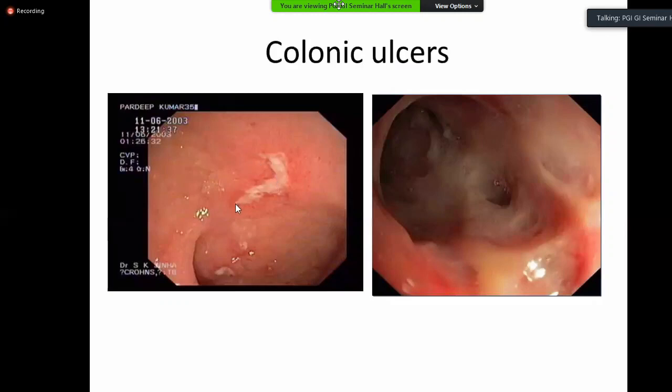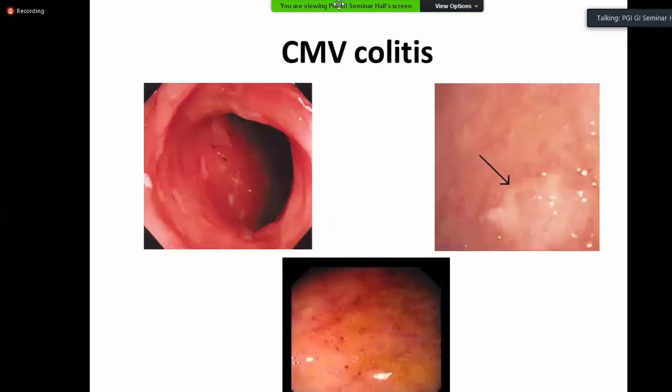So you define the shape of the ulcer, the size of the ulcer, and you cannot say that it is deep in that sense that you are measuring the size of the depth. But you can see that the mucosa was somewhere here. This whole area is ulcerated, shallow, and then here is a deep excavation, which by common understanding goes beyond the mucosa, beyond the submucosa even, and radiologically this will appear as a deep, stud-like ulcer if you do a barium contrast study. So you define the depth of the ulcer to an approximate level.